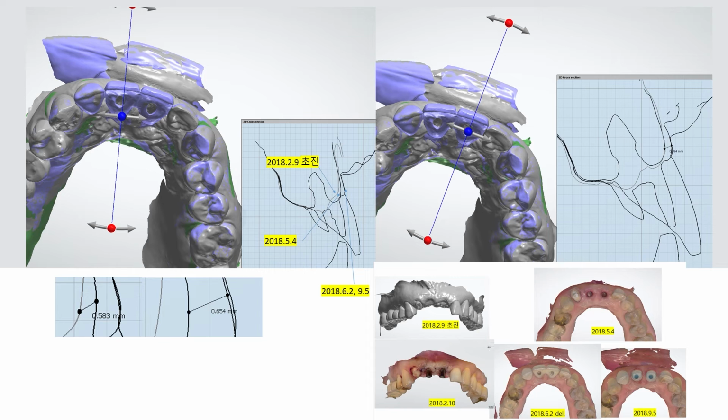So, the screw abutment results in the final abutment, from the gingiva perspective. The temporary results in gingiva molding, so increasing the buccal volume is possible, in other words. And when you remove the temporary, the immediate external change is not much, but internal slumping could happen. You should consider that in creating the final abutment. That could be the conclusion we can draw from here.